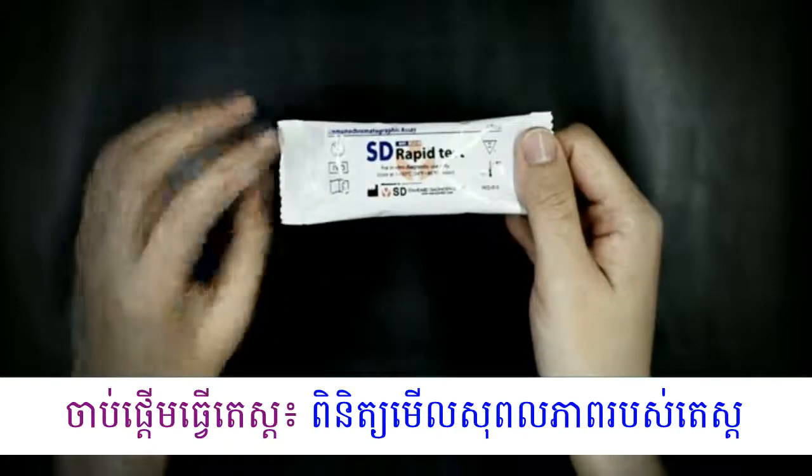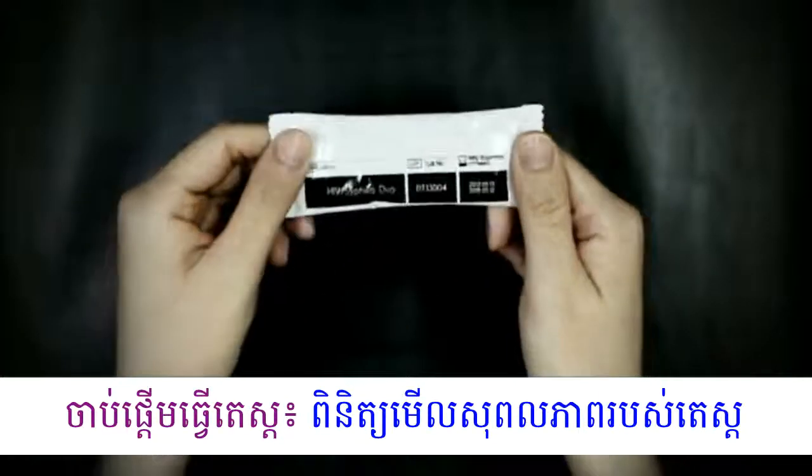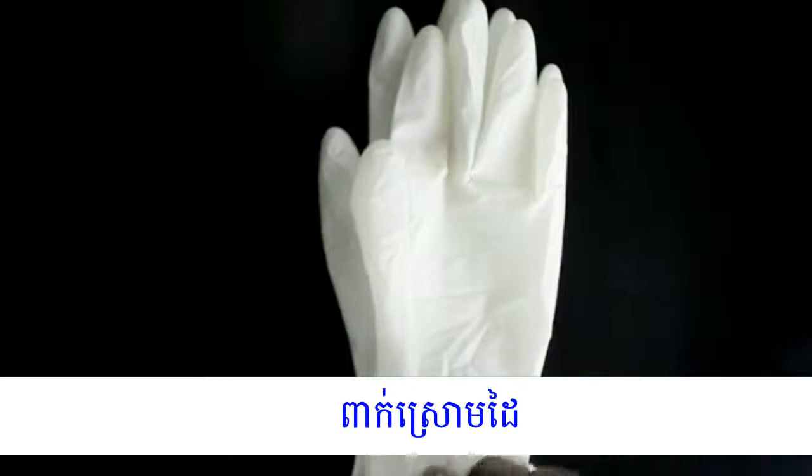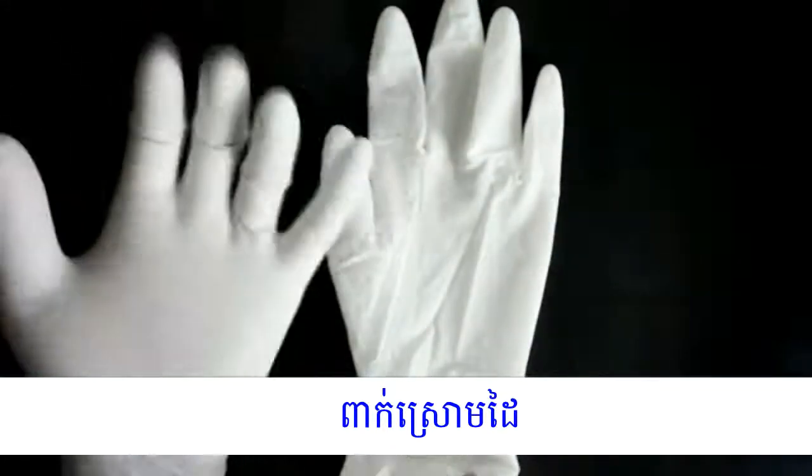Check the expiry date on the back side of the test pouch. If the expiry date has passed, use another kit. Put on the gloves. Remember, use new gloves for each patient.